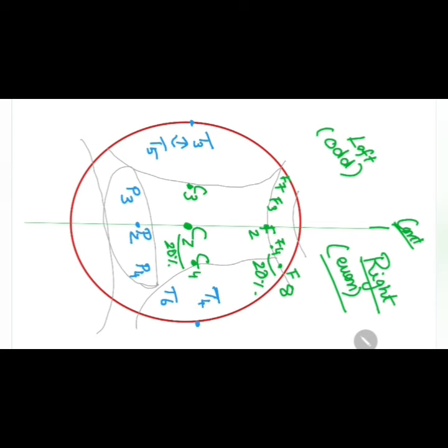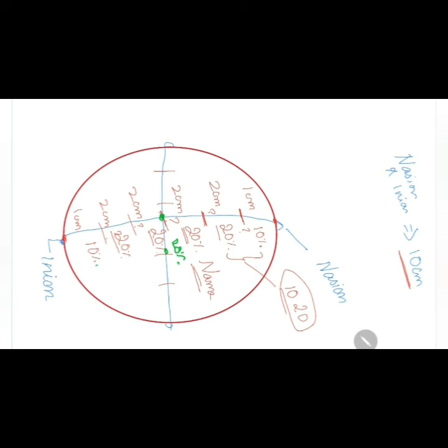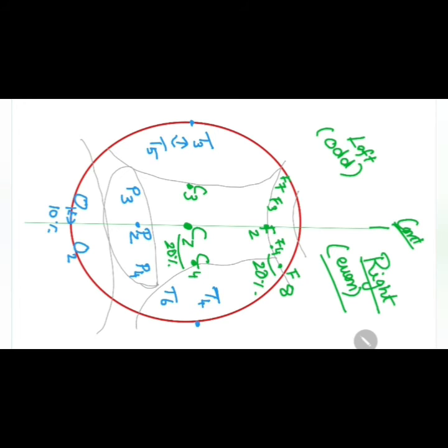Then after that, on the other side, in the occipital region, we don't need a center point, because the center point would become the inion, right? So we don't need that. So instead of placing on the center, we'll place O. This should be O1, this should be O2. The reason is the difference is only 10 percentage. See, to justify it, let's go back and see this region has only 10 percentage, right? So distance is only 10 percentage. So O1, O2. Right. Similarly, on the top, FP1, FP2.